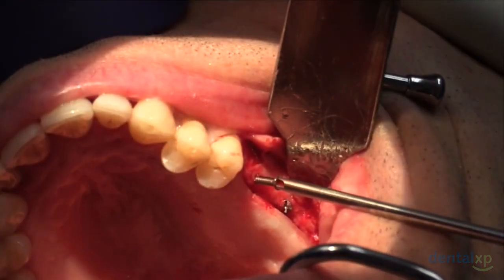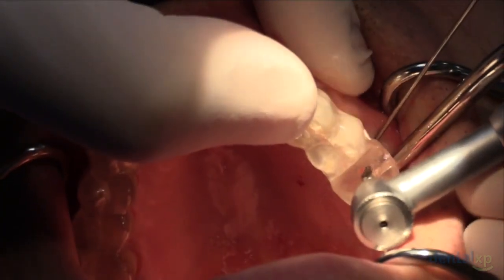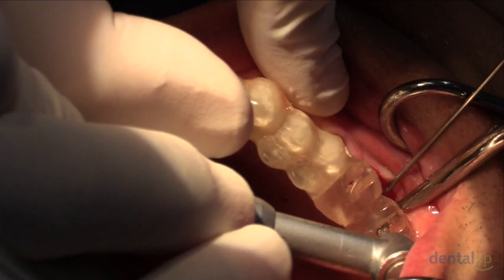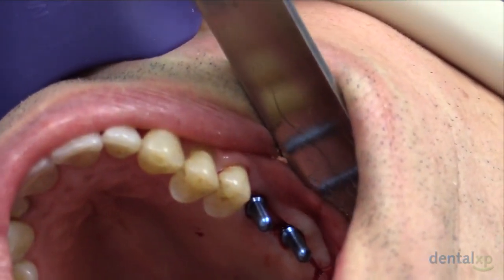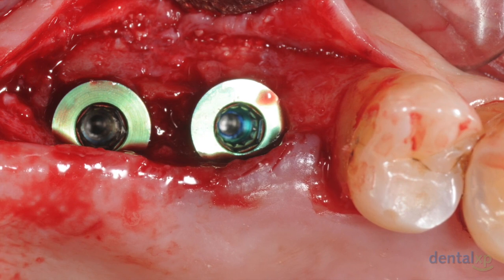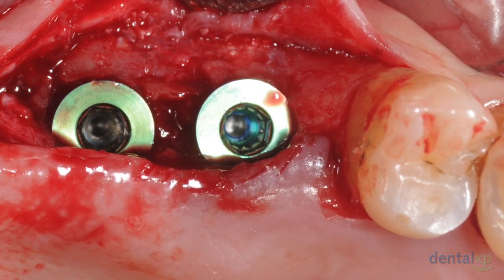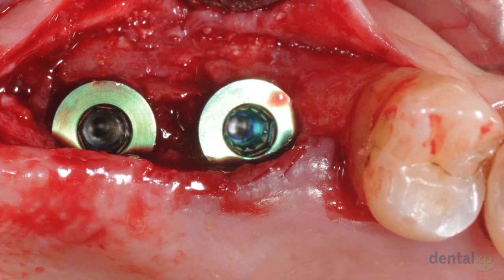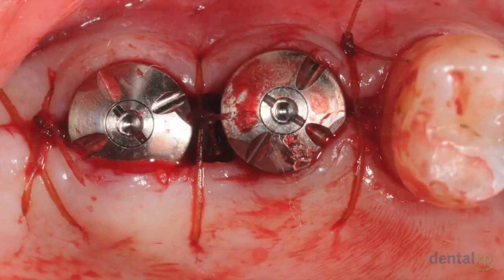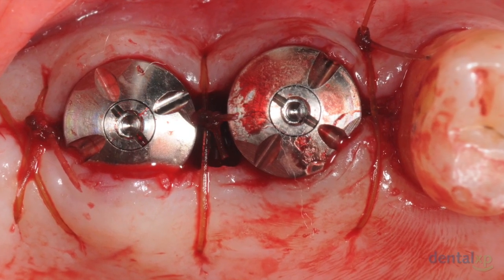The fixation screws are then removed, the surgical guide is positioned, and our initial implant sites are prepared. The guiding pins are then placed to confirm the trajectory and the position. Implants are then placed, and because of the cortical nature of the bone graft at the crest, they have great primary stability. So we can proceed with a single stage placement of the implants and the healing abutments.